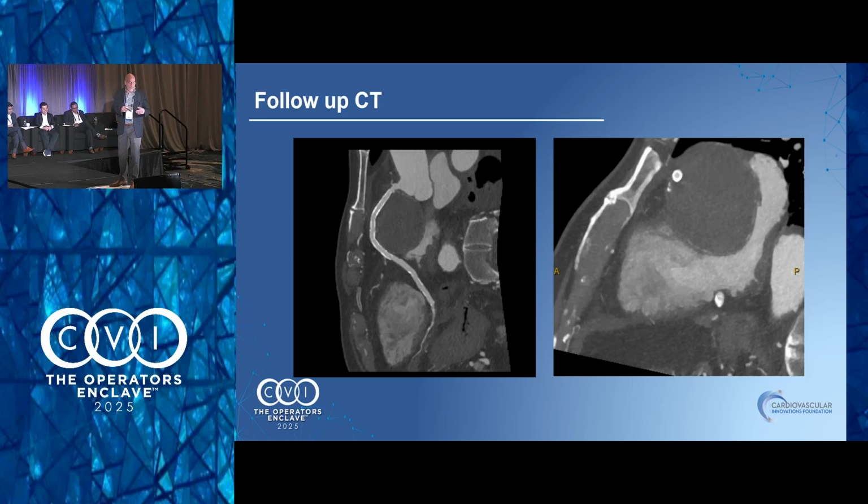And then, this is not super recent, we got a CT. This is just a still frame, but you can see all those devices. And on the right there, you can see that nice circular thing within this now not filling aneurysm.